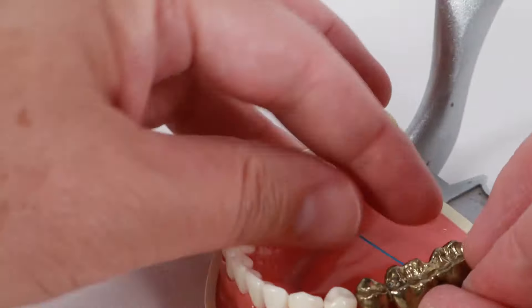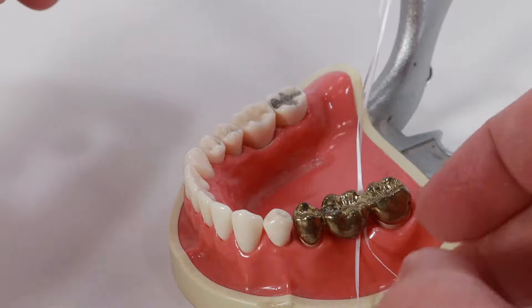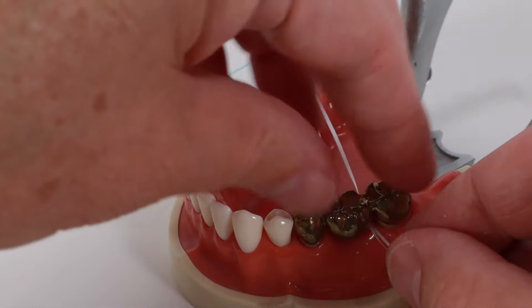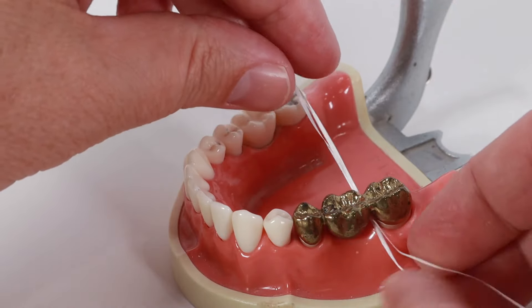You take the end of the floss threader and insert it underneath your bridge or retainer. Since it is a bit stiff, it will easily go under your bridge without hurting your gums. You grab the end on the other side of the bridge and pull it through until you have the floss underneath your bridge or retainer, and now you floss.